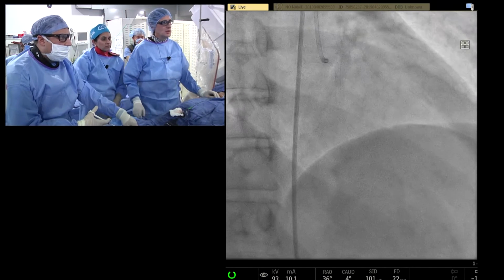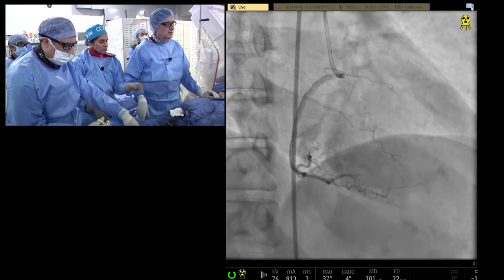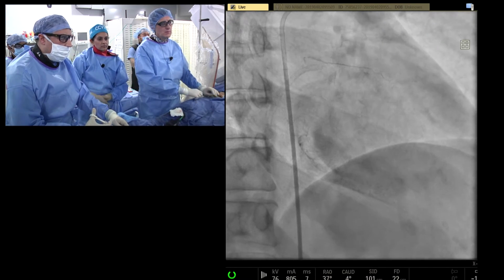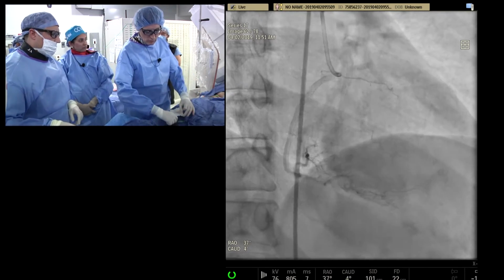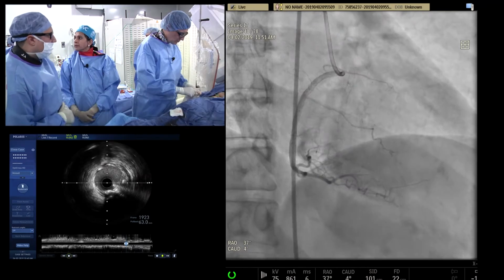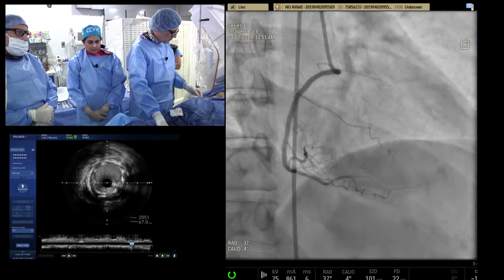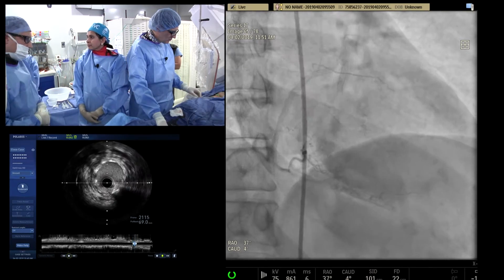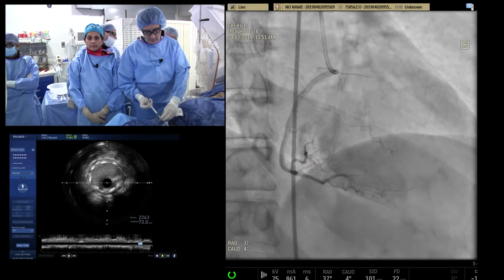That's a very interesting concept. It was first started, I think, from Dr. Colombo in 1995, when once upon a time all patients were getting Coumadin after a stent, and he showed that with the use of IVUS and optimal stent implantation, actually you could avoid that and use an antiplatelet regimen instead, and having a lower rate of stent thrombosis. So intravascular imaging and optimizing the procedure actually impacts then the pharmacologic decision that we can have.